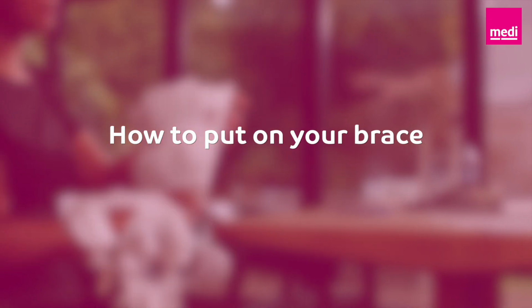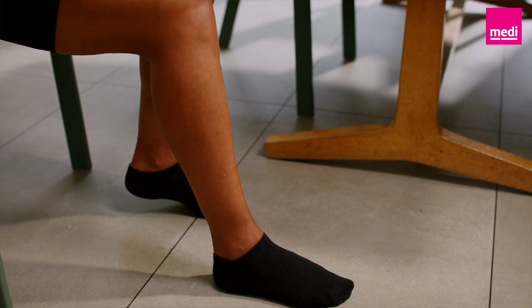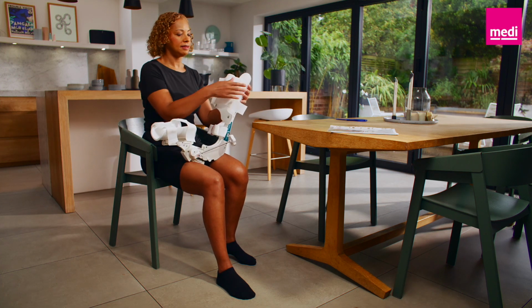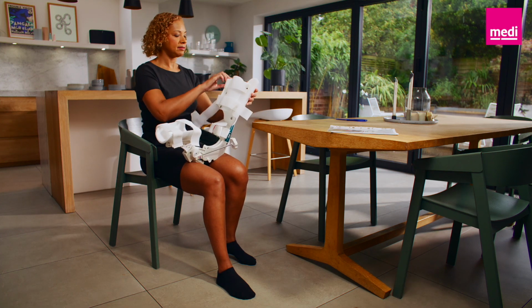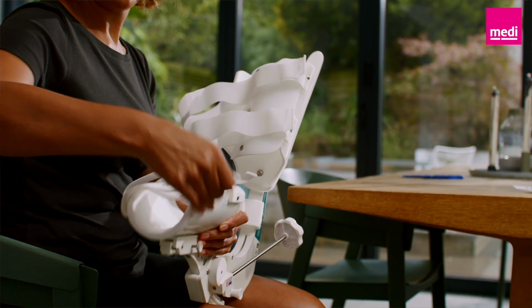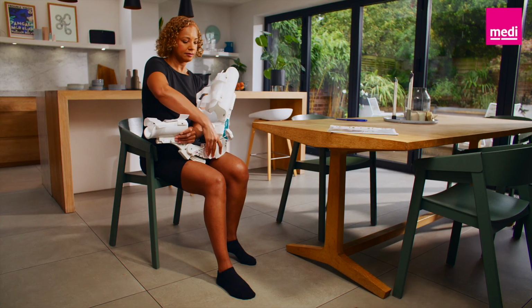How to put on your brace. For your JAS therapy, it's best to sit upright in a stable seat like a dining chair. This will help you to stay in the right position throughout the session. Wearing a sock may help your foot slide easily on the floor. To get the best results, place the brace cuffs directly against your skin. Avoid fitting the brace over clothing, as this may cause it to slip out of position during use.